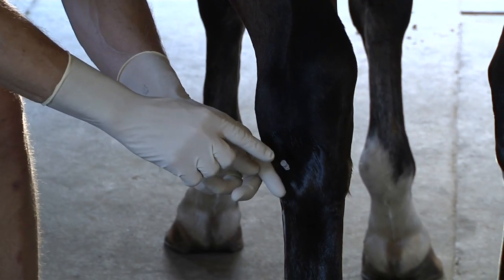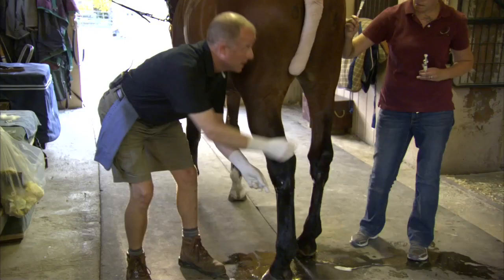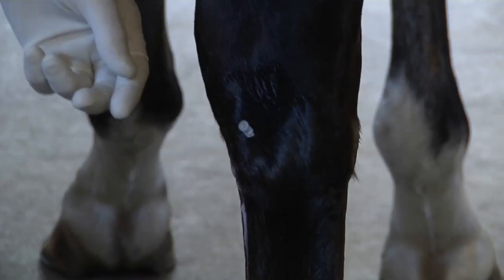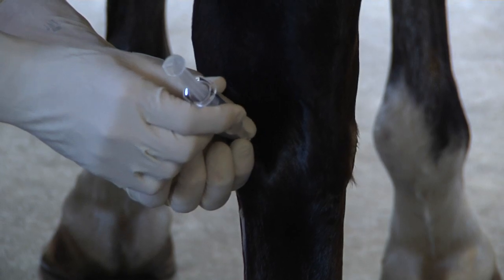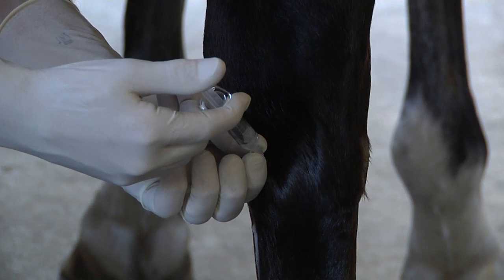Now you may not be able to see, but there is joint fluid that has come up into the hub of this needle, and that is what we're looking for to make sure that we're in the right place. I attach my syringe and then slowly inject.